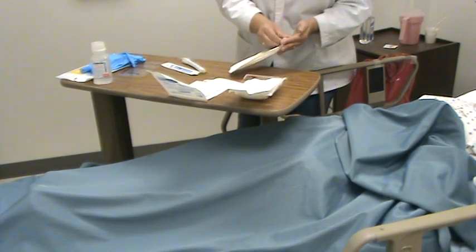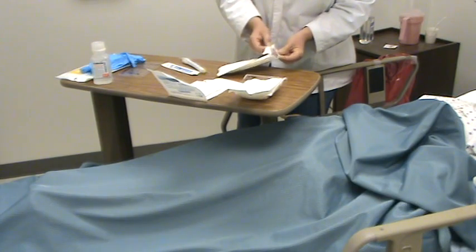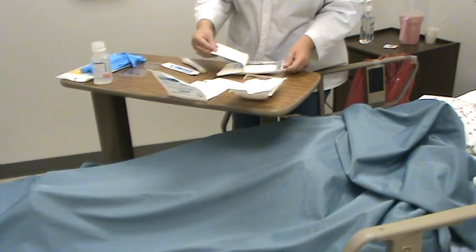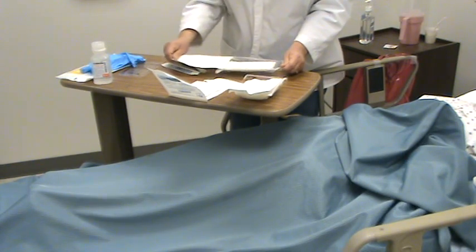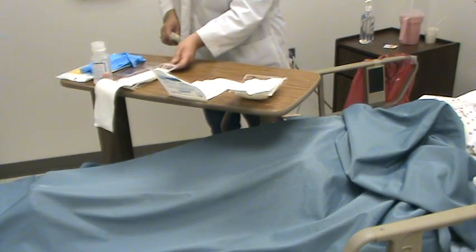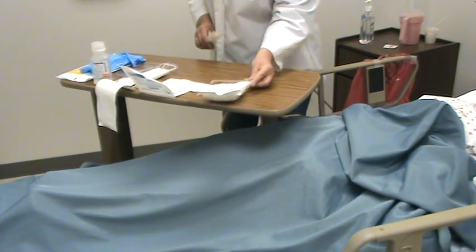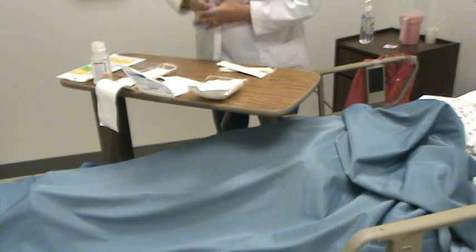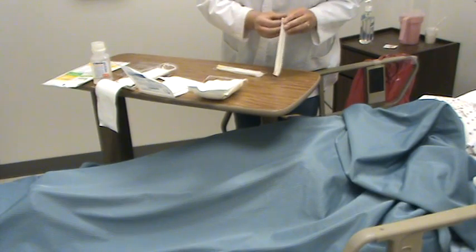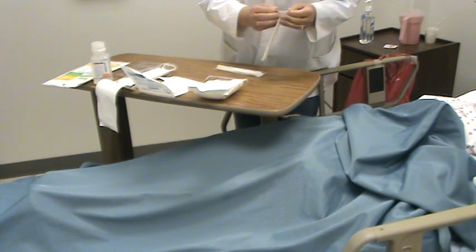You can open them in any order you want, you can put them in any order you want — whatever works for you. We're looking at making sure that you know how to open packages and when something does become contaminated, what are you going to do about it? Because you can always rearrange these things. My cotton tip applicators — there are different ways that you can set these up to be able to use.